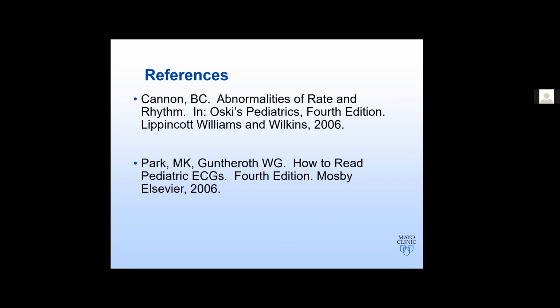In addition, the ECG is not that sensitive. You can see very marked ST segment changes and other things in a patient that just has pericardial irritation and no effusion. And you can also see very large effusions with a completely normal ECG. So I think you have to go based on the myocarditis criteria that are published in the sports recommendation guidelines.